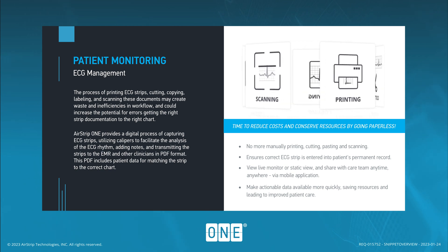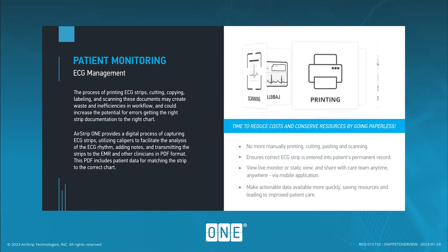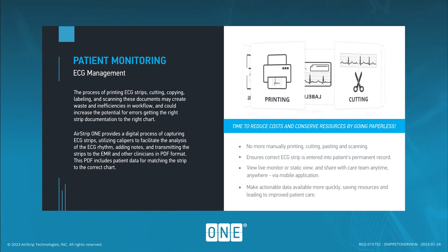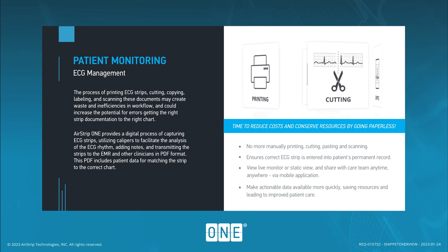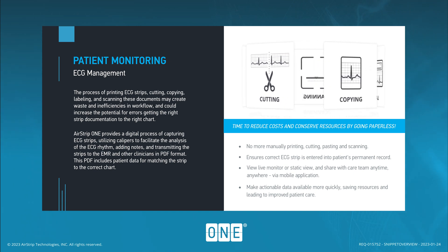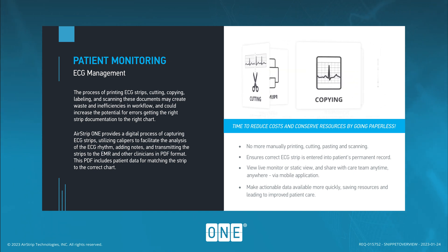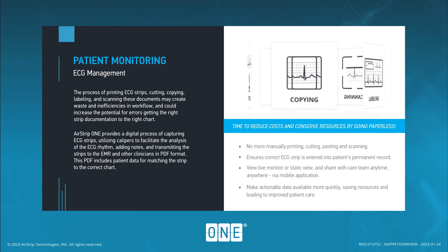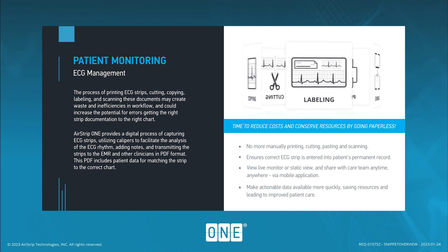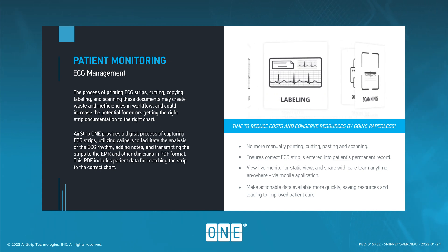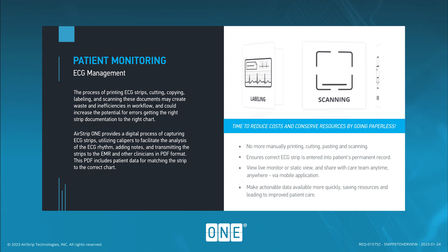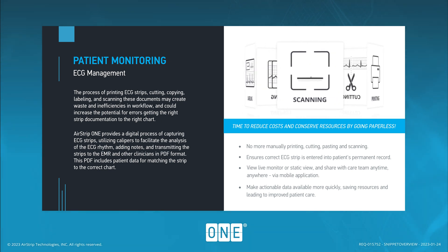Airstrip1 provides a digital process of capturing ECG strips, utilizing calipers to facilitate the analysis of the ECG rhythm, adding notes, and transmitting the strips to the EMR and other clinicians in PDF format. This PDF includes patient data for matching the strip to the correct chart.